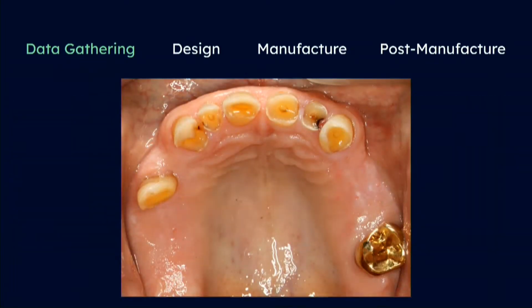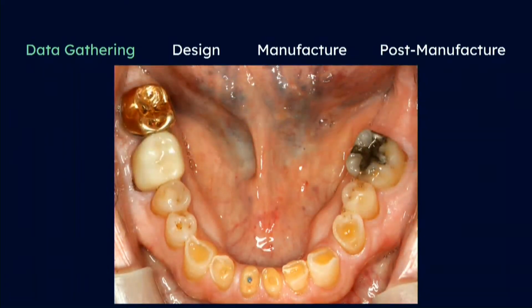Our findings are still confirmed in this image of the maxillary arch with the amount of severe wear and carious lesions on a couple of teeth. On the mandible, we can appreciate a wear pattern that gets more and more aggressive as we move more and more anteriorly in the arch, rendering the restorability of his incisors questionable.